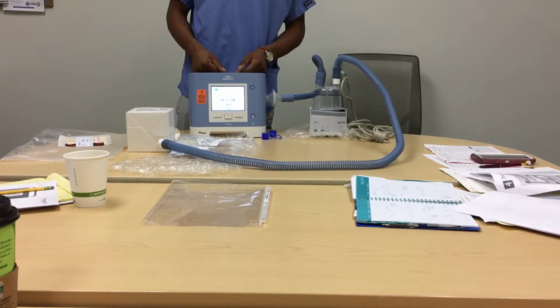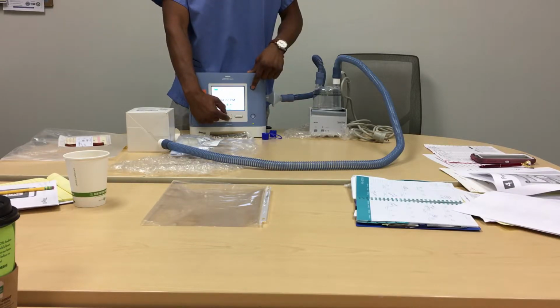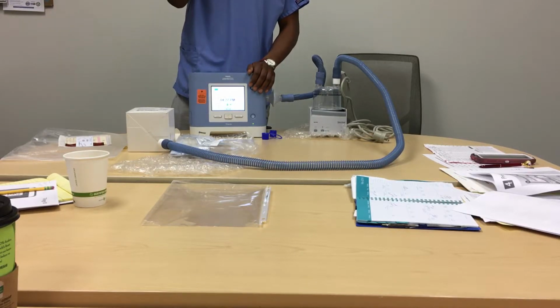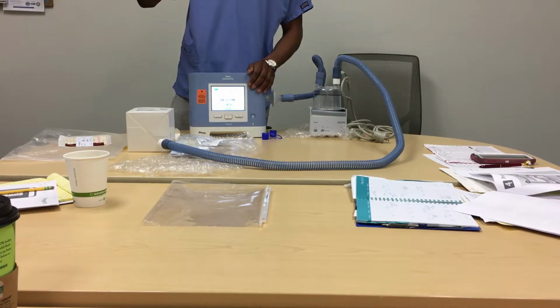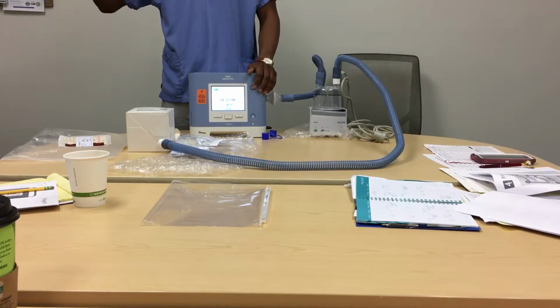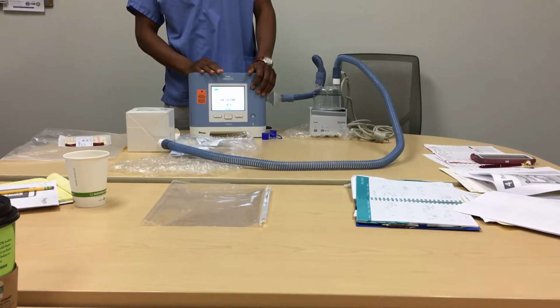But are you able to lock them out? Once they know how to get in there, they will always do it. So there's no code, it's just a sequence of button pushes. Correct. And how often then are they checked? With us, when we set them up initially, we do a 3-day follow-up call, a 7-day visit, a monthly visit for the first 3 months. Then after the first 3 months, it's quarterly. But for VA patients, they will do a monthly visit. That's the requirement. And with this, you have to physically touch it to make changes, you cannot do it remotely. You can't track this via modem remotely, on Wi-Fi? No, ma'am.